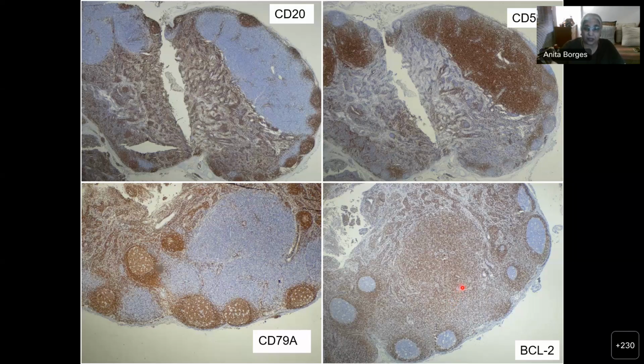And those follicle centers, you know, are follicle centers. Why? Because they should express CD10. Okay, so remember this: if you're seeing CD10 within a follicle and BCL2 is being expressed, then that is significant. That means that you are dealing with a follicular lymphoma.